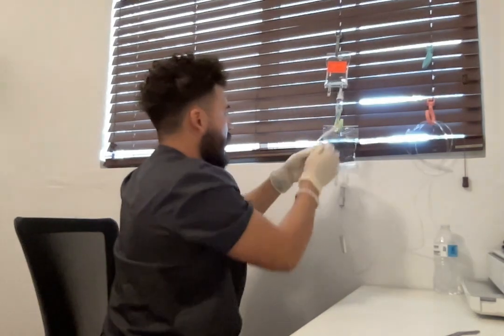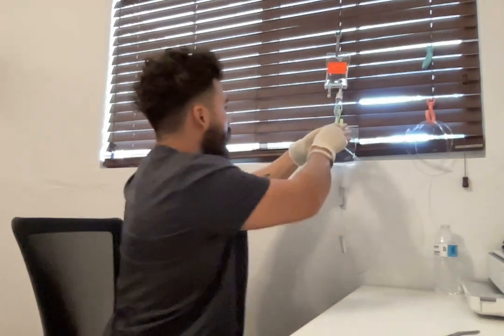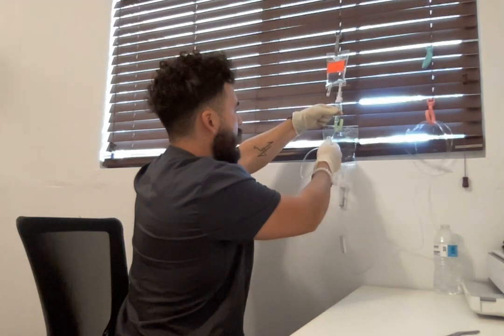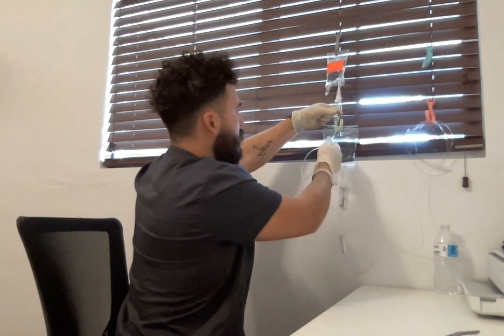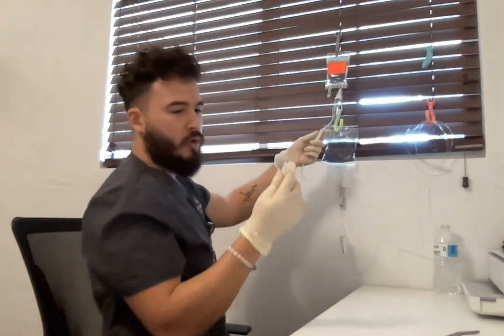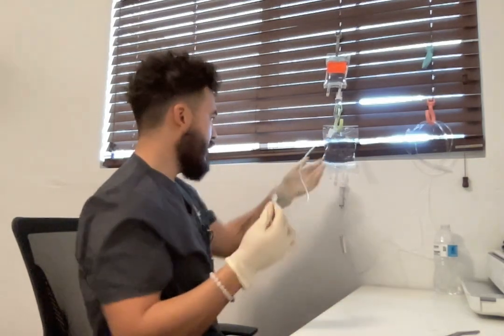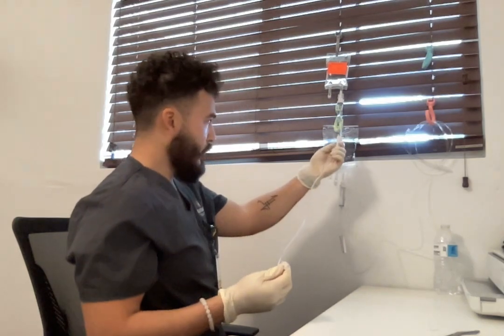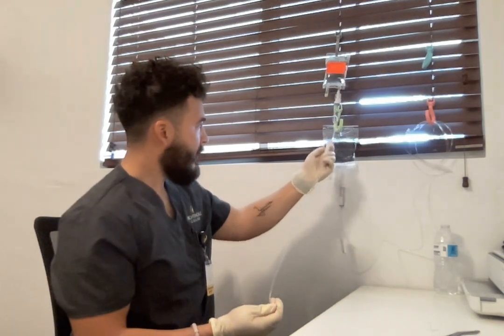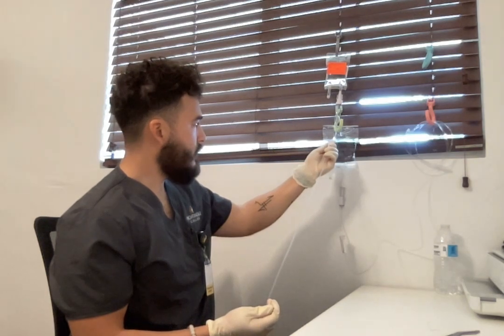Okay, now let's hang down. Let's get this line straightened out. So fully clamped, I'm gonna fill the drip chamber halfway with medication. Okay, now that it's filled halfway, I wanna remove the air from the lines. Remove the cap from the adapter, and then slowly release the roller clamp. This will allow the medication to flow, and you can see that it's dripping.